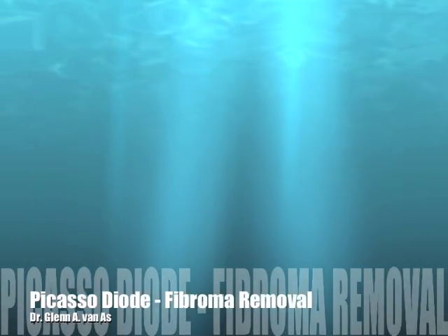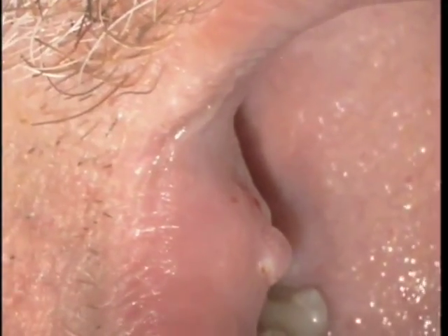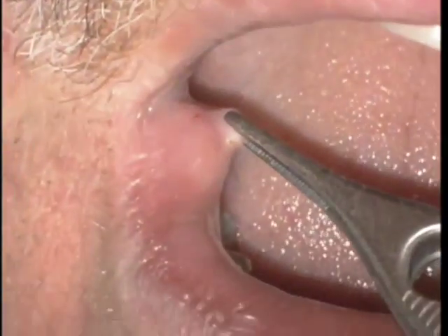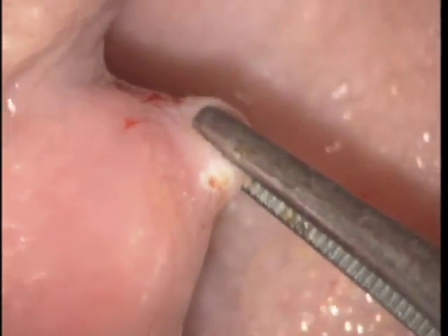In this video we're going to see how the Picasso diode from AMD Lasers is able to remove fibroma. This fibroma was on the right buccal mucosa. You can see in this video shot through an operating microscope that we're using pickup tweezers to distend the fibroma. There it is at low magnification of about 2 power and up to about 8 power.